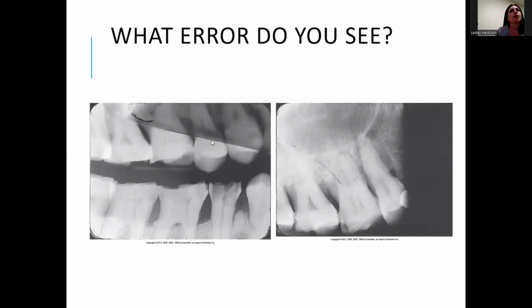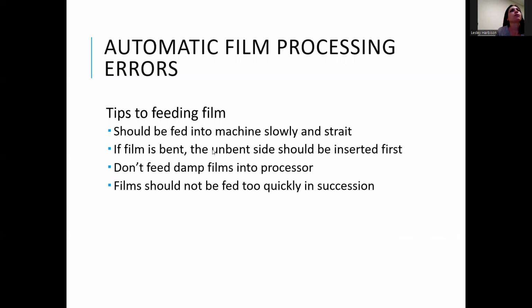Double image here. This looks like a light leak because it's kind of diffuse.